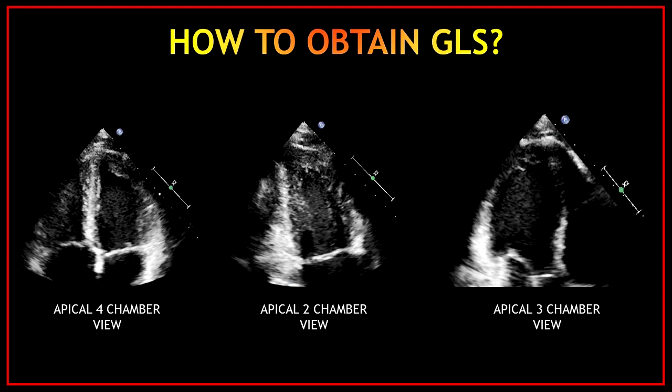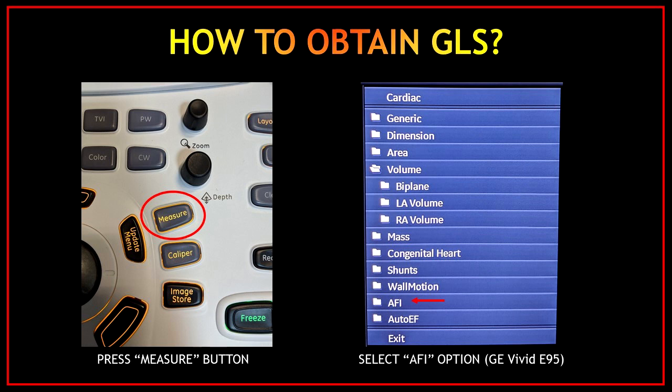So let's start with the main purpose of this video — teaching you how to obtain global longitudinal strain. First and most basic, you will need three views: a good quality apical four-chamber view, a good quality apical two-chamber view, and a good quality apical three-chamber view. Make sure to acquire all three views and that all segments are included. Just make sure to zoom in on the left ventricle. The process is very similar on every echo machine; however, for this video I'm going to be using the GE Vivid E95.